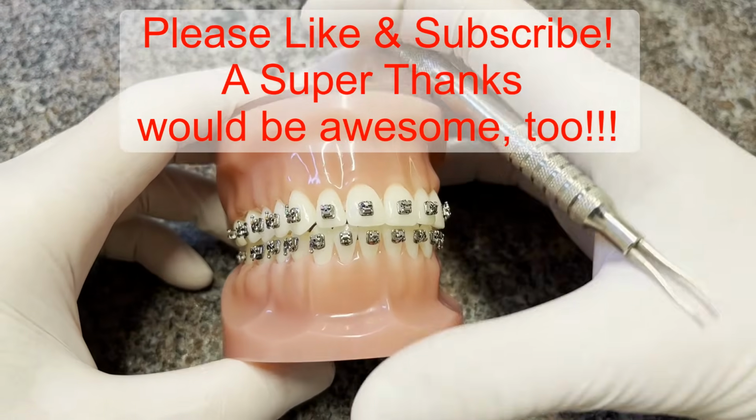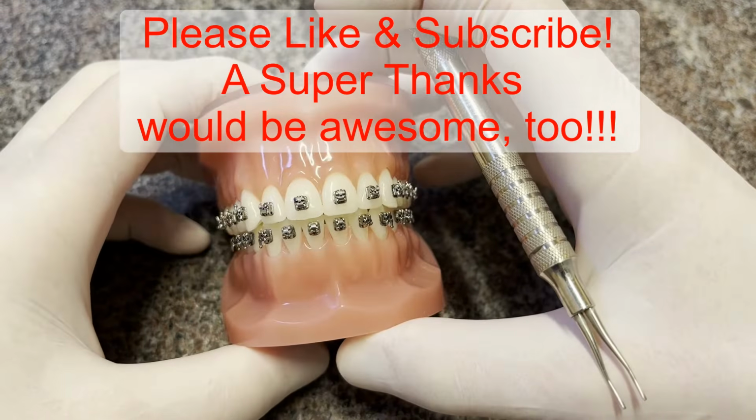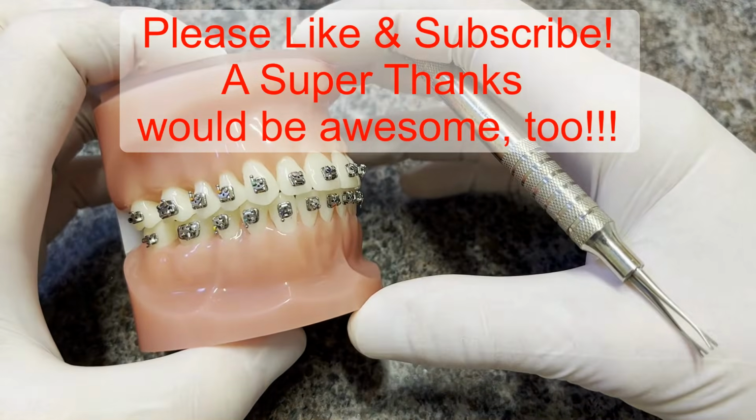Okay, so we're going to go over in this video how to place brackets on the teeth. This is going to be geared more toward the dental assistant, so kind of a rough how-to put the brackets on so that the doctor can then come over and finalize the position.